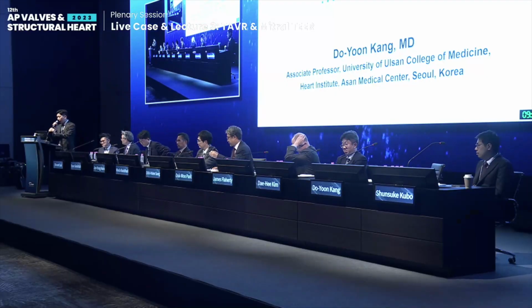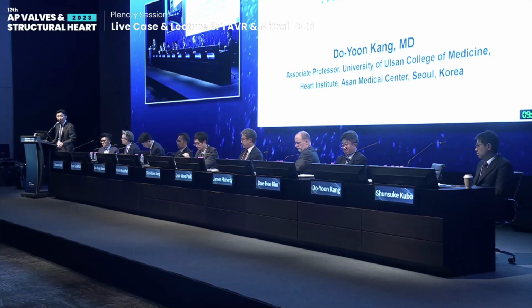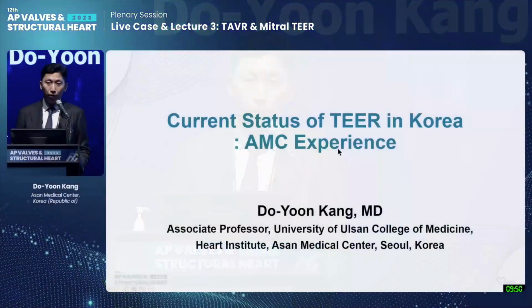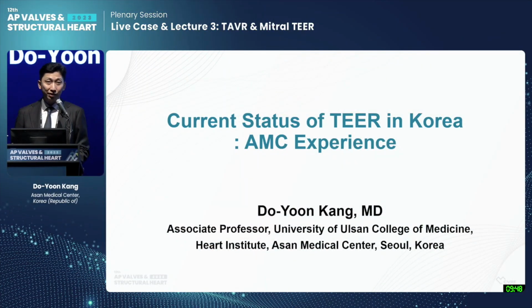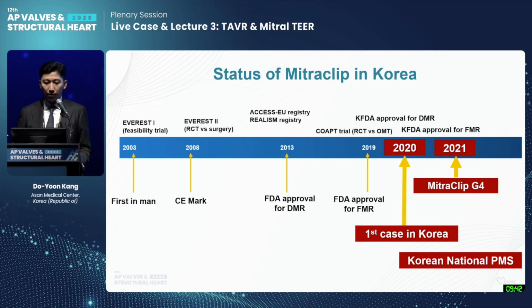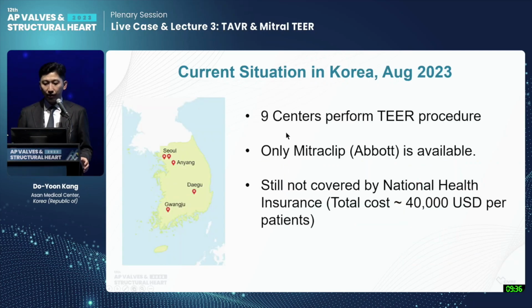Yeah, thank you for your introduction. I'm Dr. Do-Yoon from Asan Medical Center. Today I'll talk about the current status of TEER in Korea with the AMC Asan Medical Center experience. I will show you our single center experience with some data. So we began the MitraClip in 2020 and now use the G4 clip. And 9 centers are now performing TEER procedures, so Korea is still in the early learning period.